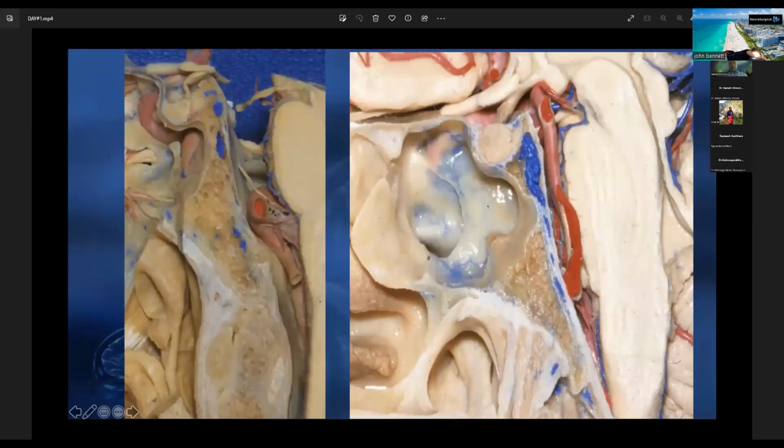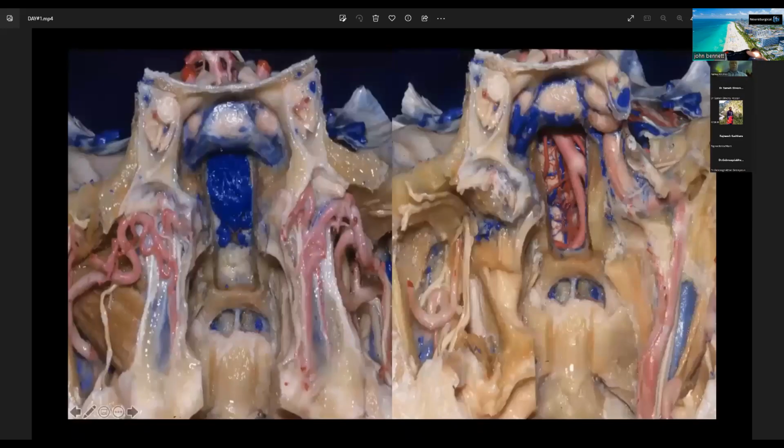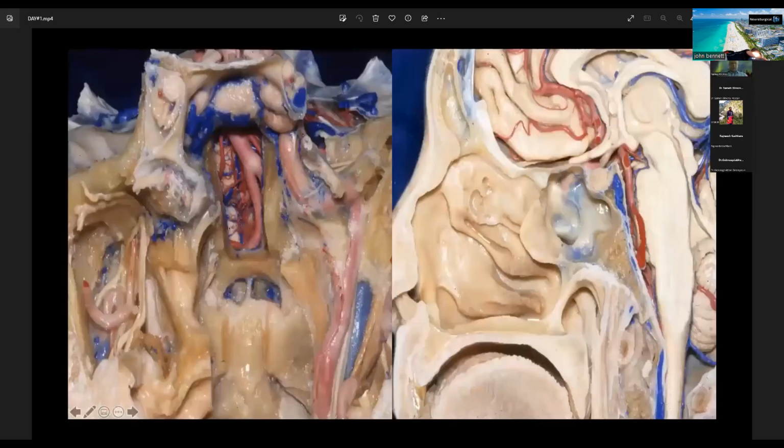And this is the relationship of the cavernous sinus and the sphenoid sinus to this junction and the origin of the sixth nerve. So this is a complete anatomical exposure of the clivus, but only the upper part is reached by the sphenoid sinus. You could see the lower part of the sphenoid sinus exposes mainly the vertebrobasilar junction. But for any lesion that you see on the scan below that, you would need to go below the sphenoid sinus, as most of you know.